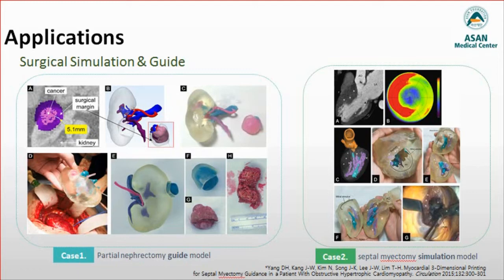They stated that the 3DP phantom provided intuitive information on the LV geometry, including the extent of the hypertrophied septum, the location and length of the papillary muscle and intraventricular muscle band, allowing preoperative simulation of the surgical myectomy.